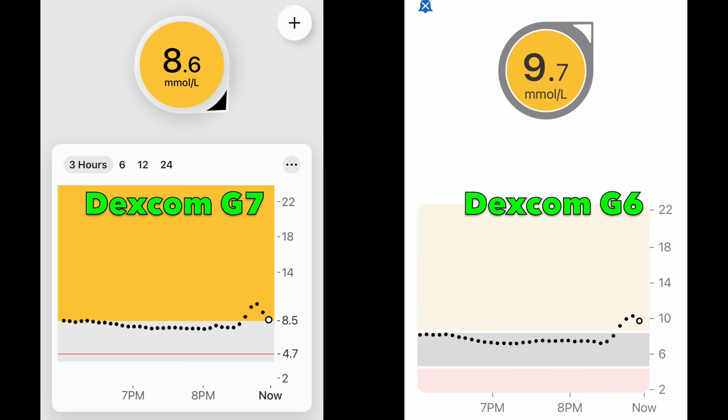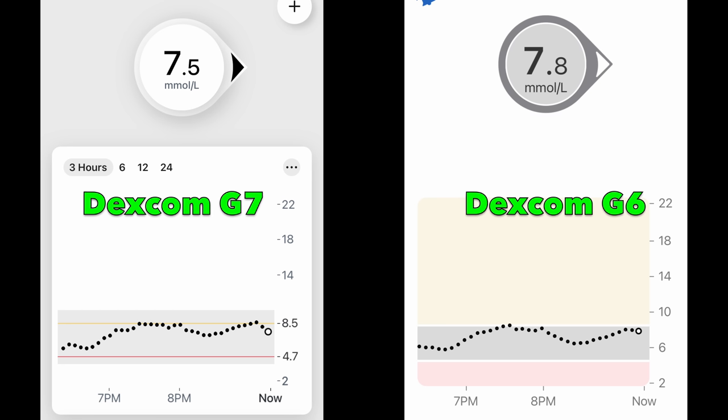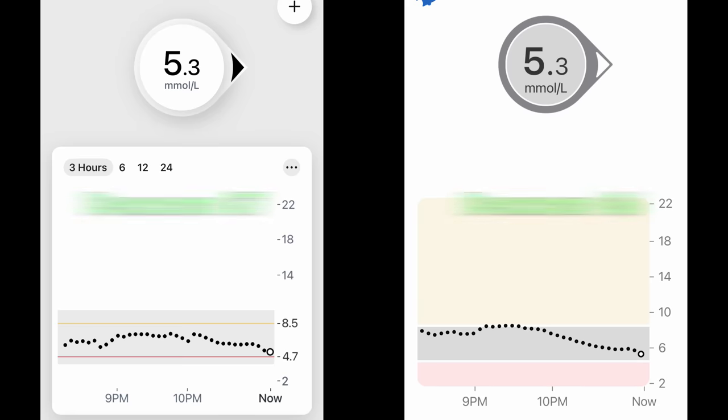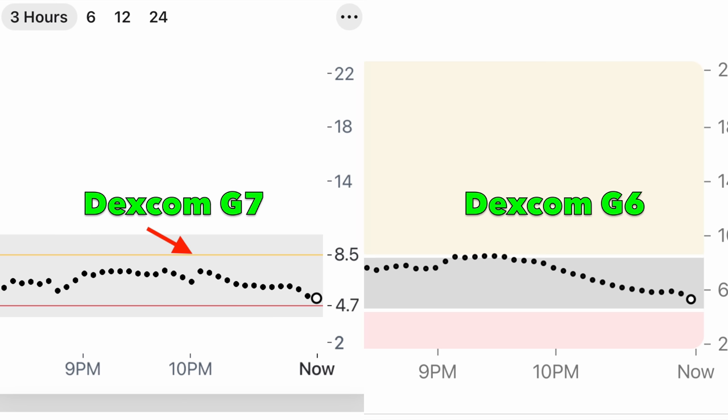One reason for the jumps is that the G7 tries to be more real-time than the G6, which requires the system to work with projections into the future. You can see the G7 detecting a glucose drop one step ahead of the G6. These projections are not always easy to do, especially when we suddenly change what we're doing. For example, during a 10-minute walk my blood sugar always drops — the G7 graph dropped much faster than the G6, because it was expecting the drop to continue. When I stopped walking, the G7 jumped back up.